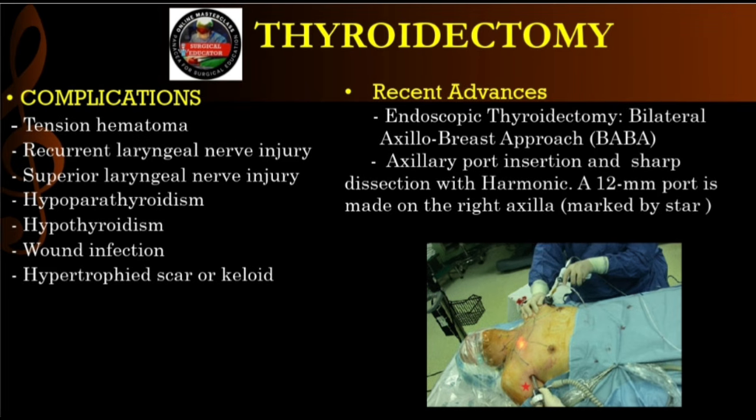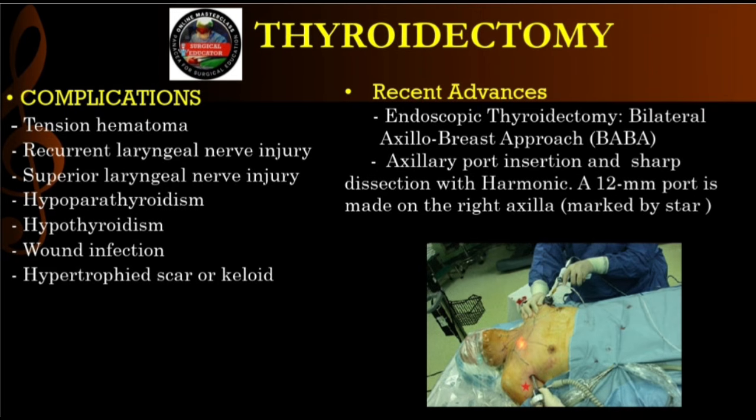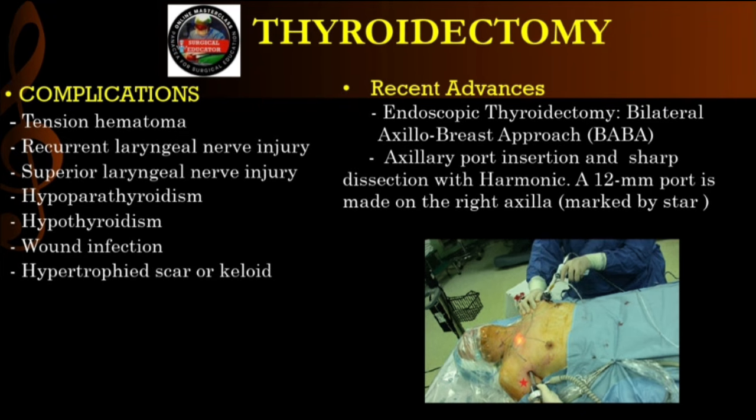All right, let us pull back from the operative field. It is time for you to pull yourselves out of the mental movie. Congratulations on completing this exhaustive, layer-by-layer mental rehearsal. By visualizing these exact steps, from the avascular platysma plane down to the lethal traps around Berry's ligament, you're laying down the critical neurological pathway. Building that deep autonomic confidence. Exactly. When you implicitly understand the physiological why behind every single maneuver, the physical technique follows naturally and safely.